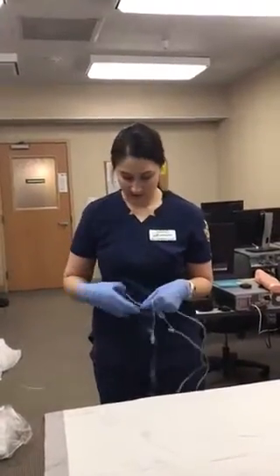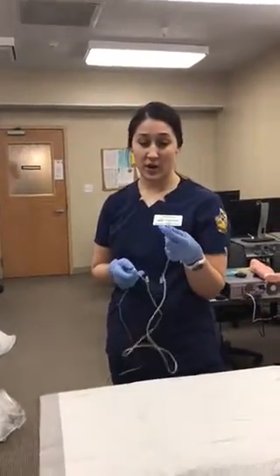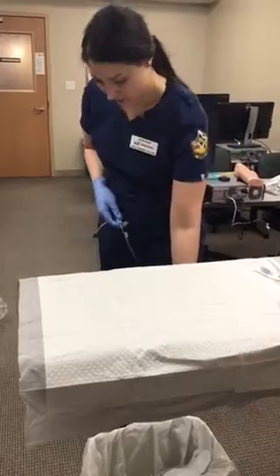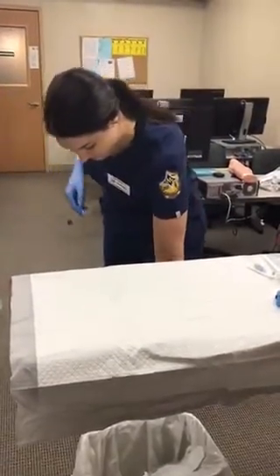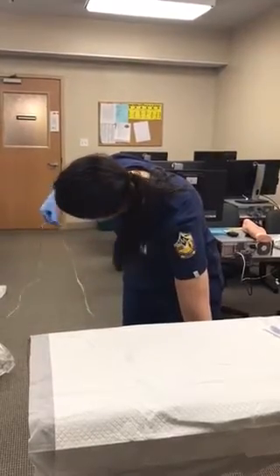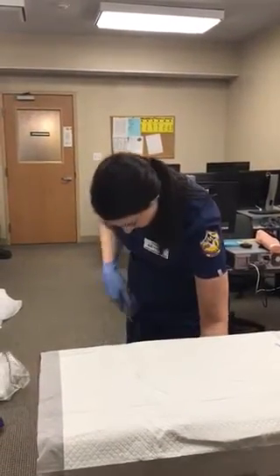So I just kind of spaced out a little bit. I'm going to undo this first clamp, and then I'm going to take my roller clip. You want to leave the protective cover on so that you maintain sterility of this. So we're going to let it open wide up, and we will prime this tubing. Just want to make sure I get all those little air bubbles out of there. All right, and that looks good.